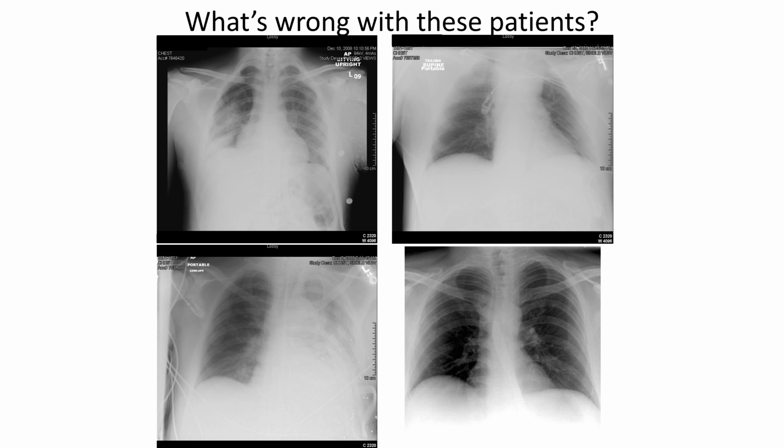that was this scenario. The chest X-ray at the top right was a patient who came in with chest pain, and normally that would get worked up as a possible heart attack, a myocardial infarction of some sort. But what frequently gets missed is another thing, which is semi-apparent here. You can see there's a very wide mediastinum, so that white tissue directly above the heart is much wider than it normally should be. And this is an aortic dissection.